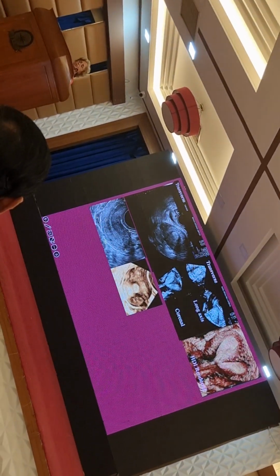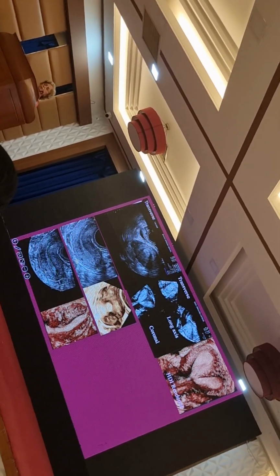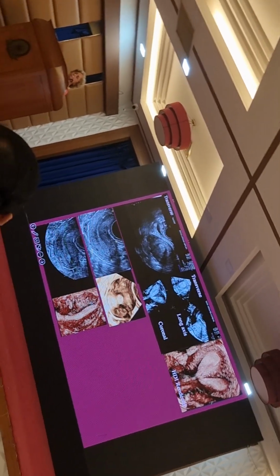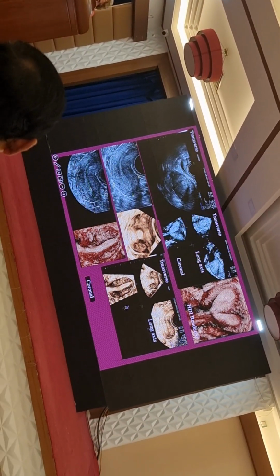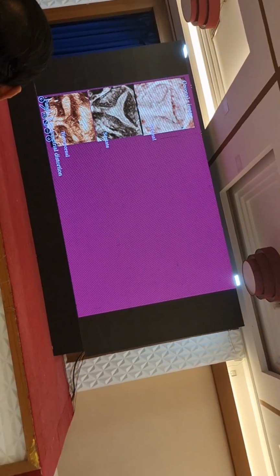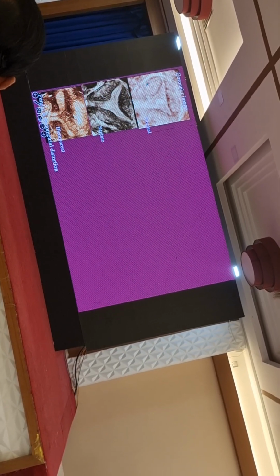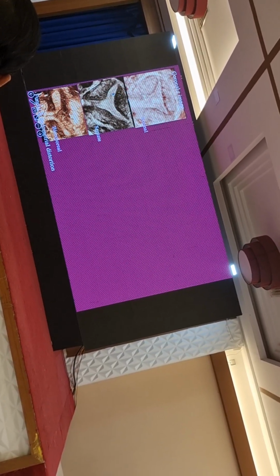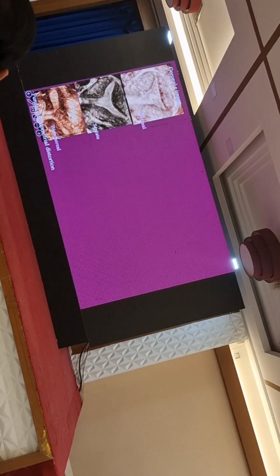And here's another patient where, on the long axis and transverse view, we would have completely missed it if we didn't do a coronal plane, where we found that this is a didelphys uterus. This was the same patient on multiplanar images and a rendered view. Now, coronal images are very good to delineate Mullerian anomalies because you can look at the fundal contour and we can also look at the internal indentation on the endometrium. And in this patient, the 2 cavities are very far apart.